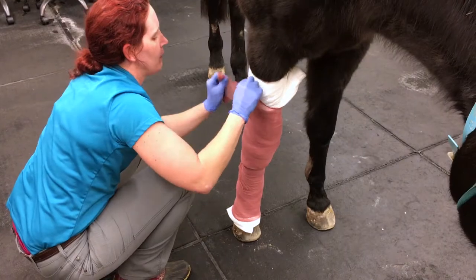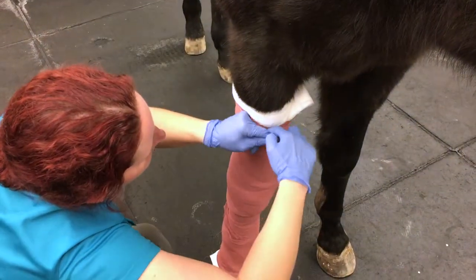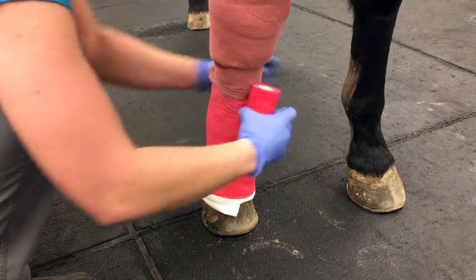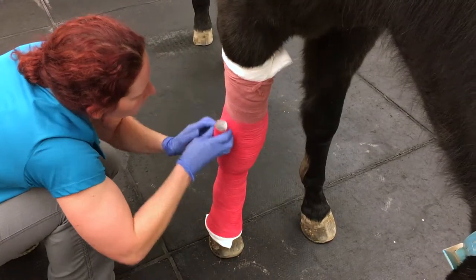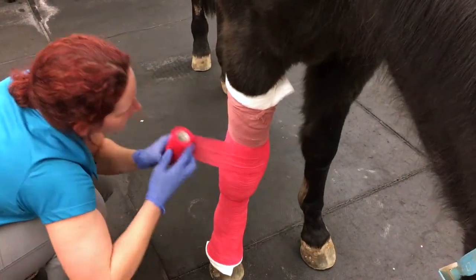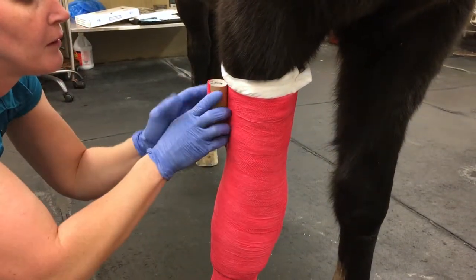This roll you can go past the bottom since it has an overlap, but you do not want to overlap at the top onto the skin. Apply the vet wrap starting at the bottom, taking care to avoid wrinkles, overlapping about halfway with each turn. You need two rolls because you run out around the carpus on this horse. When you finish, you want to finish at the top.